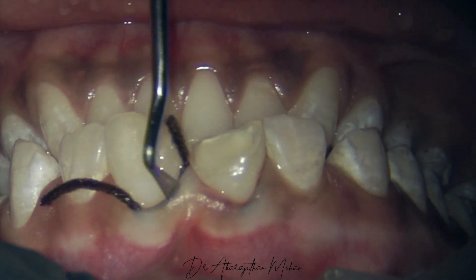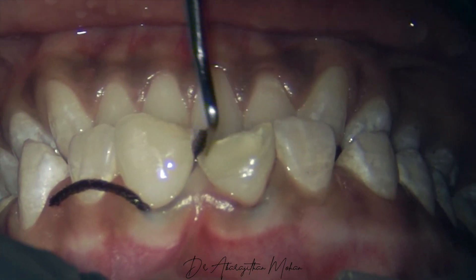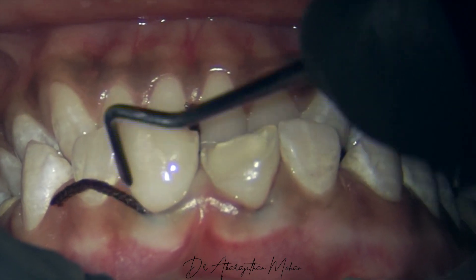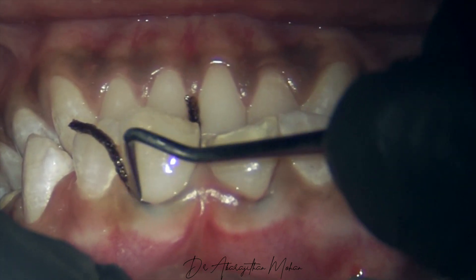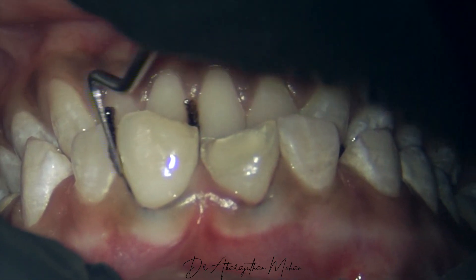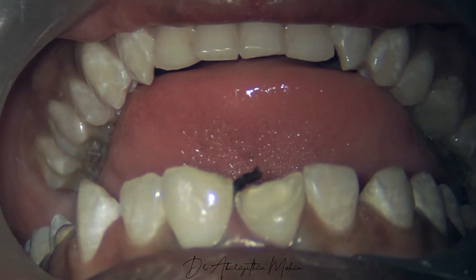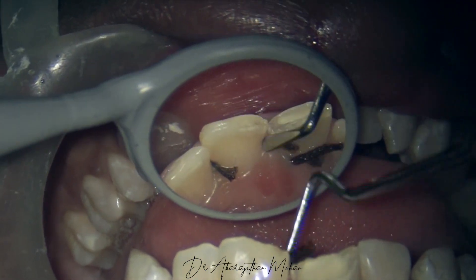Now I'm placing it on the next tooth. You can see on the mesial side I'm able to manage pretty easily with just the retraction cord packer. But on the distal side, I'm not able to pass it through the contact as the contact is pretty tight. In such situations, you can use a double strand of floss which can push the retraction cord into the interproximal area beneath the contact.